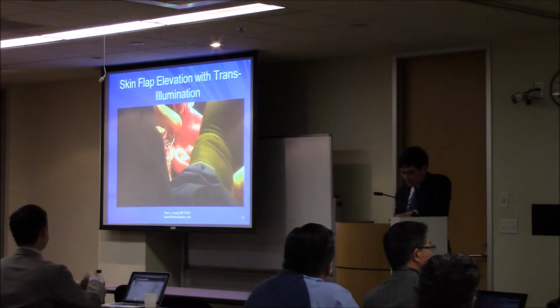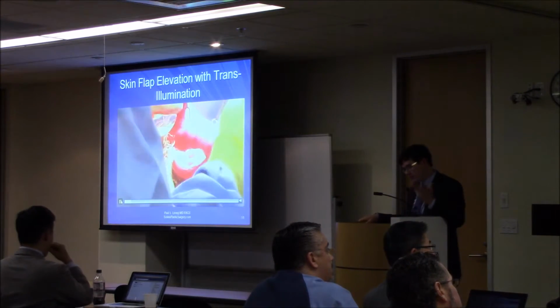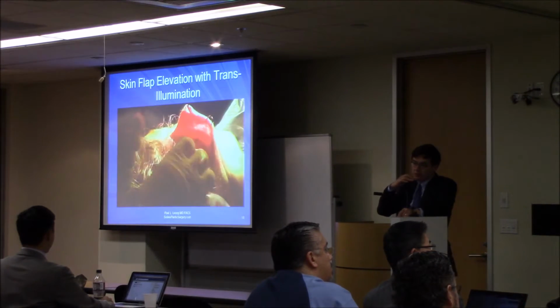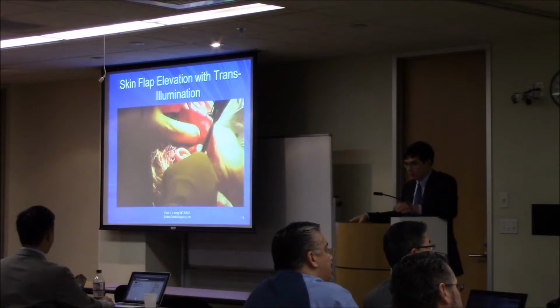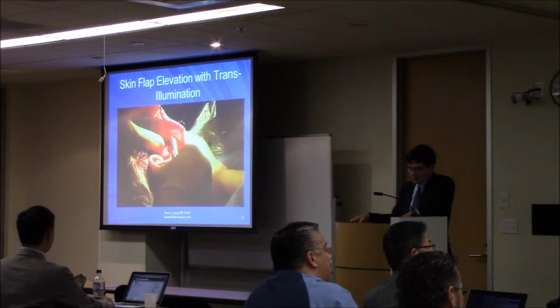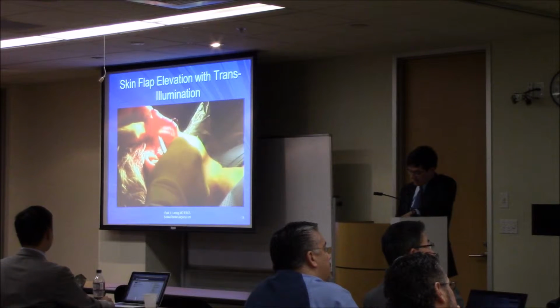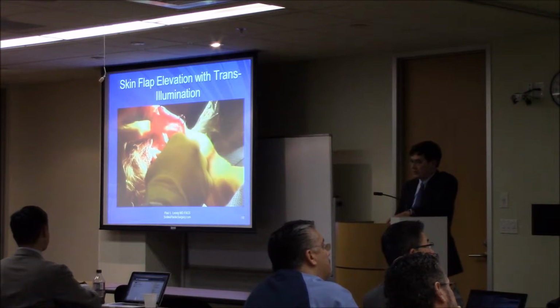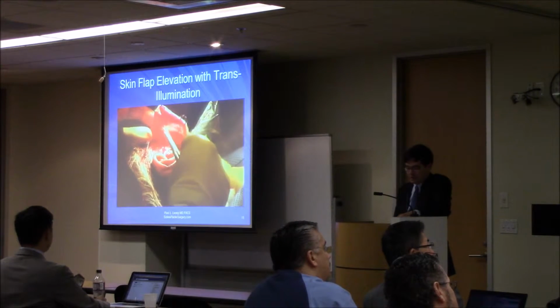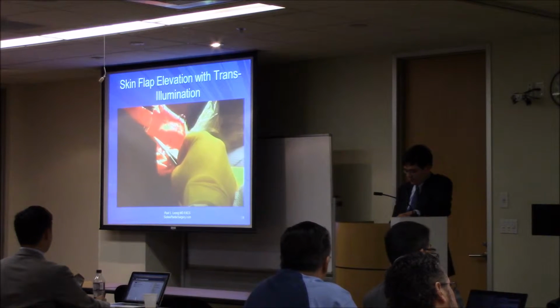So we transilluminate like that, and here's a teeny video. There's nothing terribly special about this. It's a little laborious. When you get down to about the level of the tragus and lower, you don't need to do this. Pushing scissors is perfectly adequate because the SMAS is quite a bit meatier. You can see we get the light going, and at every step you can see more light. It seemed to me like a bit of an esoteric exercise, but harsh experience shows that when I do this, I don't get the Swiss cheese SMAS flap, and when I do it the old way, I do.